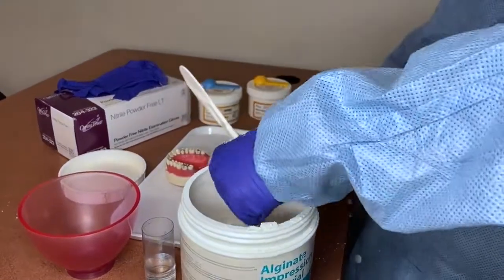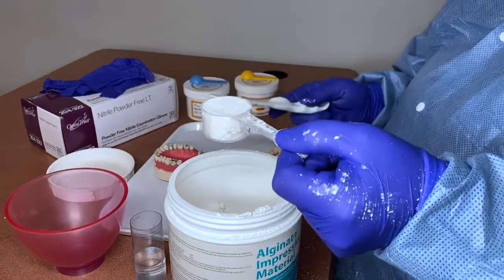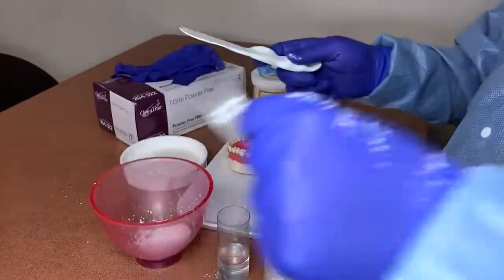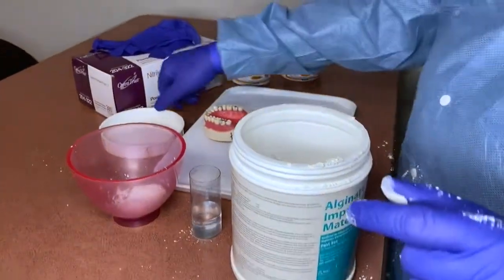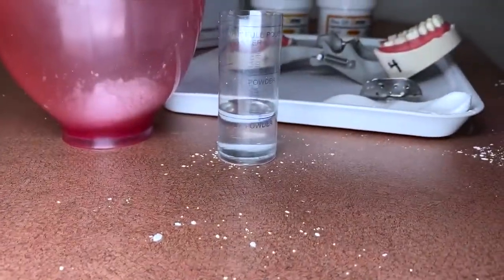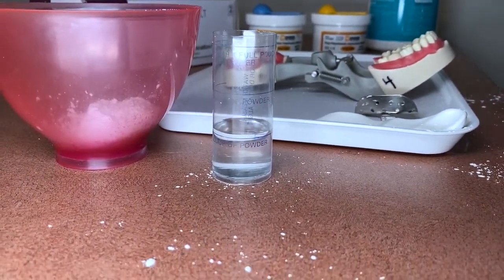The scoop is typically included in the mix. Fill one scoop, level it off, and add it to your mixing bowl. Because we're using one scoop, we only need water up to the first line, as per the manufacturer's directions.